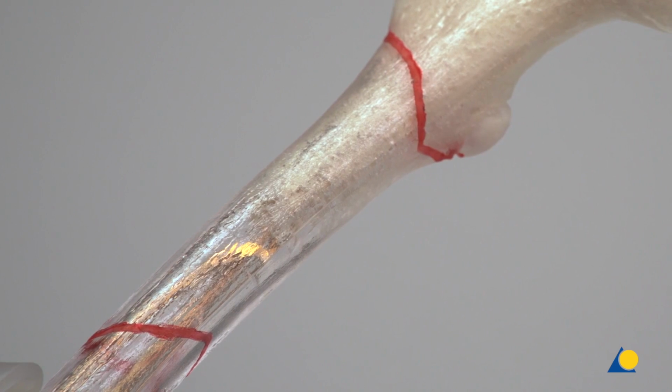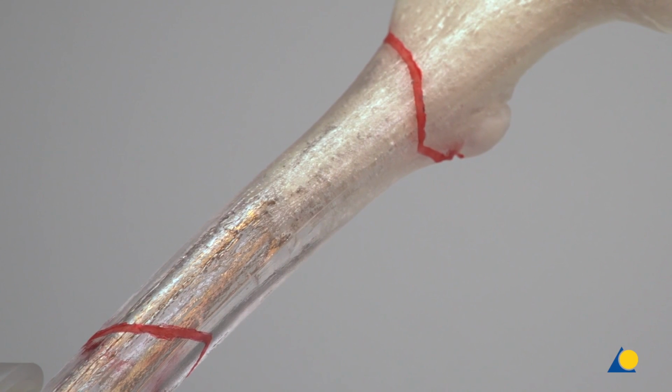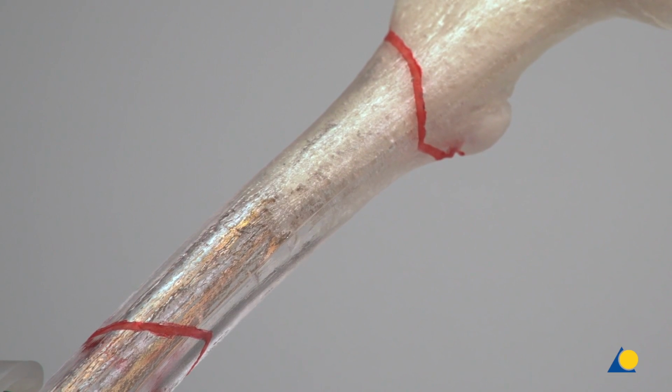Both nails are advanced as far as the metaphysis. The tips of the nails in the proximal fragment must be correctly aligned in the frontal plane. At this point of the procedure, the stability and rotation must be verified with fluoroscopy. Once the nails are fixed in the metaphysis, it is no longer possible to adjust the rotation. If a nail requires 180 degrees rotation in order to cross the fracture line, the nail must be twisted back afterwards. Orientation of the nail is facilitated by marks on the inserter.